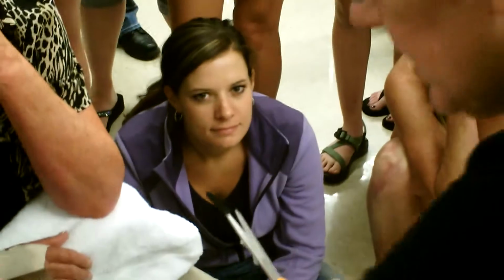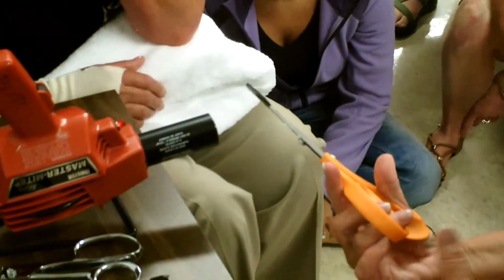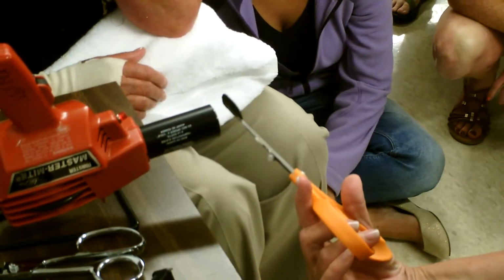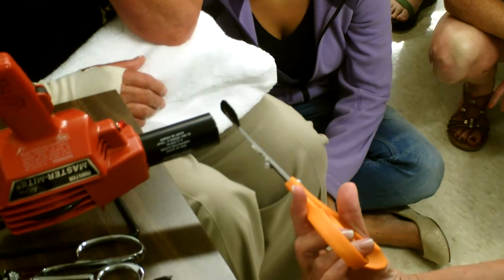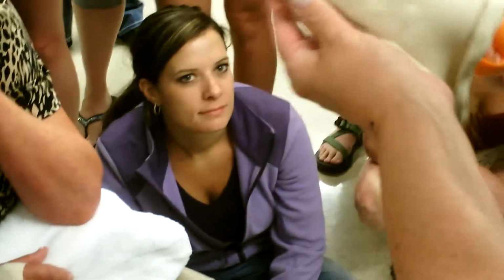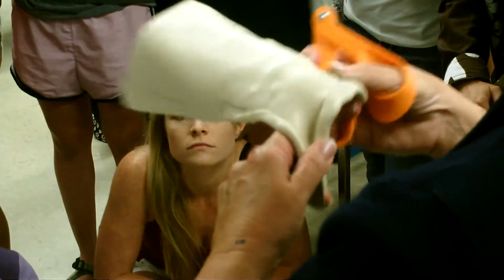Now, just a little trick, I don't know if you do this, but I do. I heat it up. The glue on this kind of curls up when it heats. You see it curling? Heat it up and put it there. That just heats the glue up, basically, and makes it stick better.